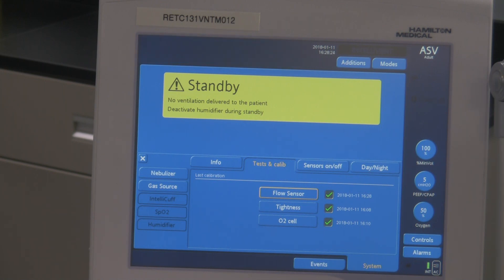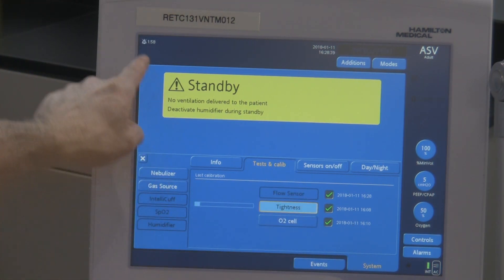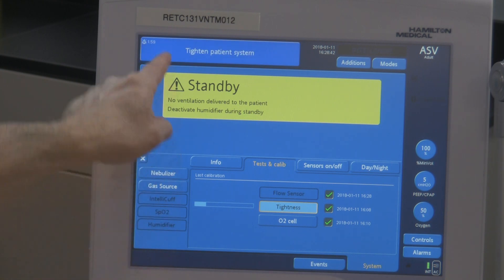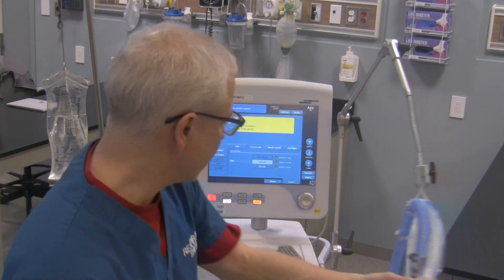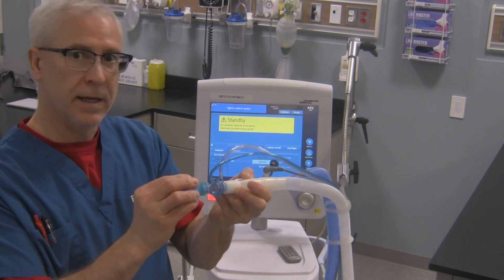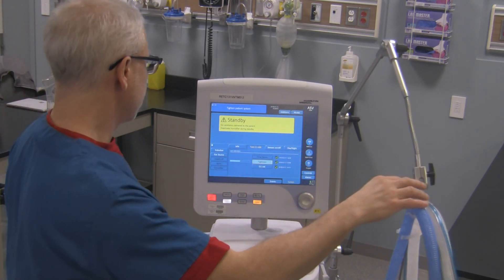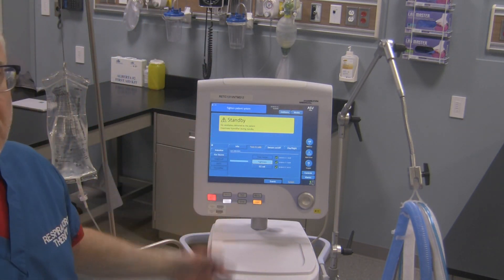Now the next test we want to do is the tightness check — that's this one right over here. You will need this adapter and this plug in order to do the test properly. I'm going to activate this next test, the tightness test. It says: tighten patient system. So all the ventilator is asking us to do is tighten up the external circuit. I'm going to take this adapter with that particular flow sensor and then place the cap on it. The ventilator, as soon as I do that, recognizes it and continues on with its test.